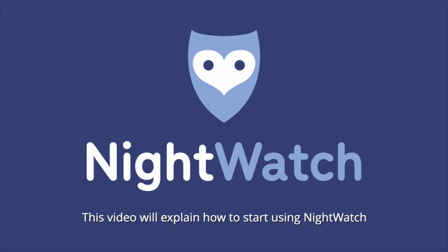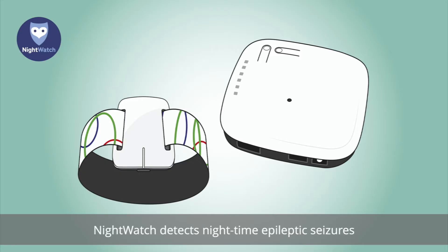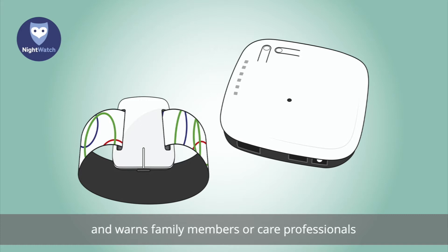This video will explain how to start using Nightwatch and how the system works. Nightwatch detects nighttime epileptic seizures and warns family members or care professionals when possible dangerous seizures are taking place.